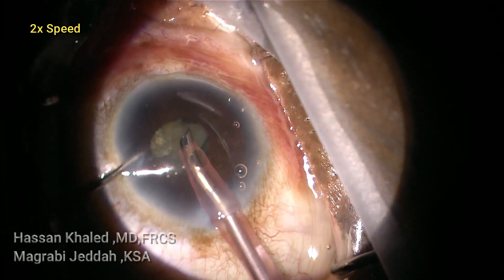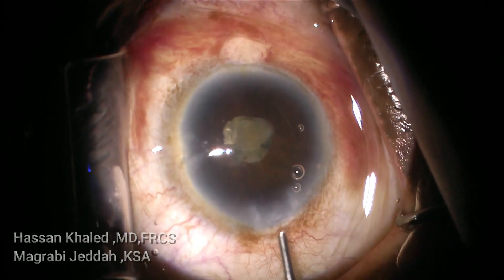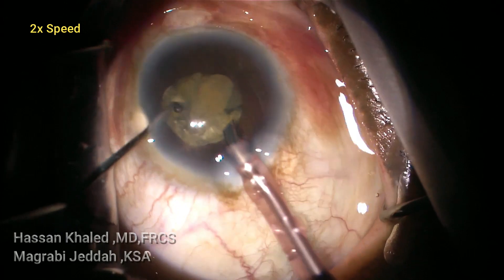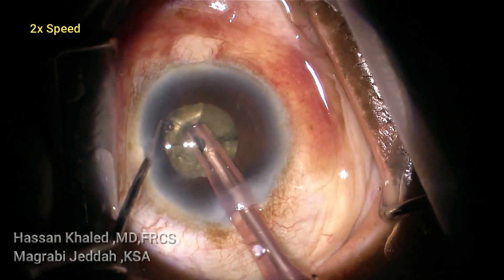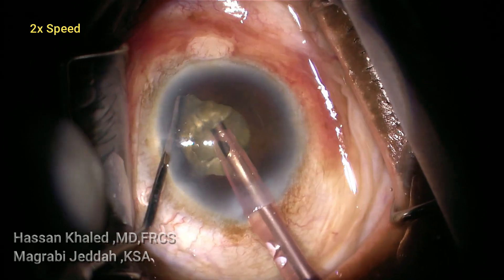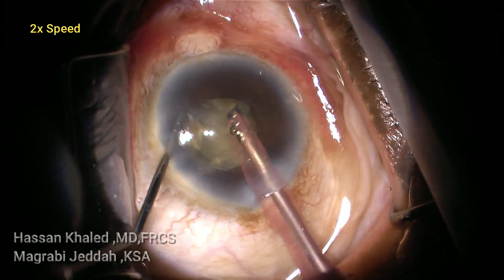You can see here the pupil — it's about 2 millimeters in diameter. Then going through the main incision and injecting dispersive OVD again to dilate the pupil and continue emulsifying.